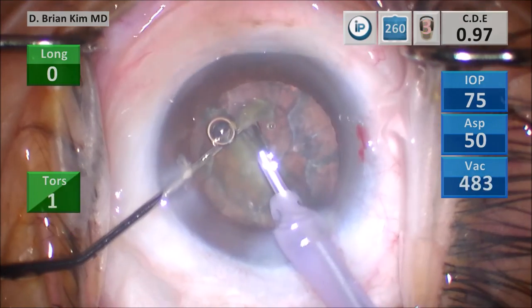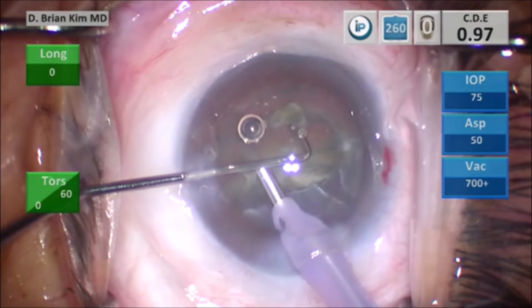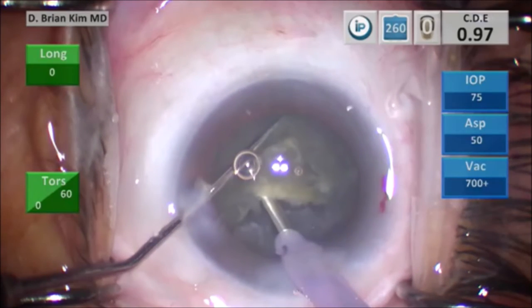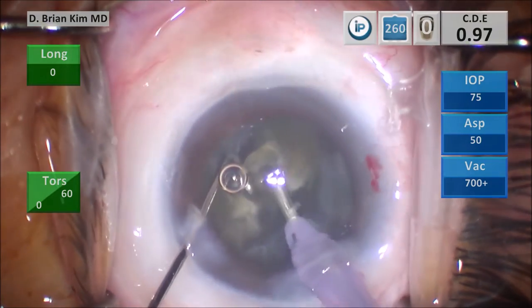The first and second quadrants are done. I'm rotating the last heminucleus in front of me. You can see the chopper is in the ready position on the surface of the endonucleus, and you can see the epinuclear ridge. I'm going to slide the chopper on the endonucleus surface, go under the epinuclear ridge. The chopper is out and now pointing down. The phaco tip is in a deep position. I pull the chopper centrally towards the phaco tip and this crushes and bisects the second heminucleus in half. I place the phaco tip not terribly deep in the bag, but deep enough so that it will bisect the lens fragments.